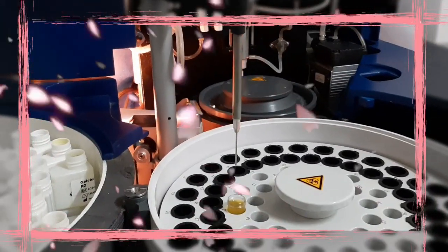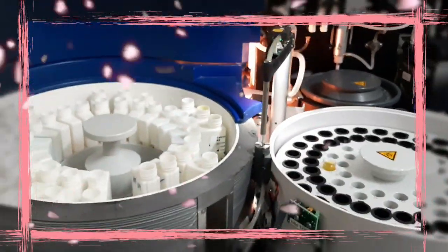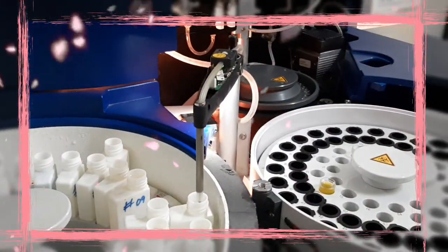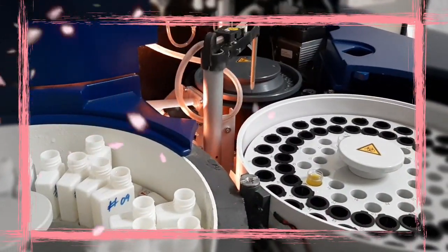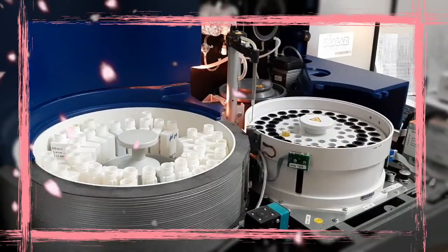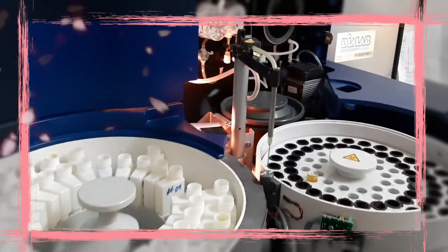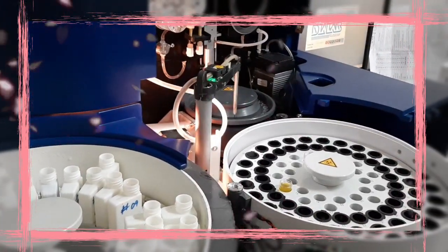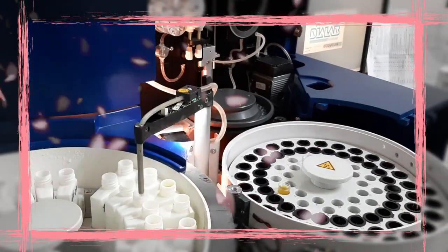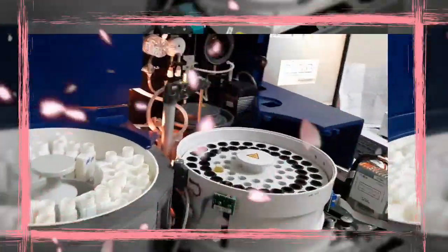I think the 80 microliter bottle is actually for the BT3000 and the 2000. It has a throughput of 250 tests per hour and is very efficient at consuming water. It's not like the other fully automated chemistry analyzers, which waste a lot of the stored water. This one, when you have about 1 liter of water, it can work for almost about an hour without finishing. There's a test directory of up to 500. And an inbuilt QC program with a minimum of 2 levels of control. It's actually 3 levels of control, and it's so wonderful. It has a photometry sensitivity of plus or minus 0.001 absorbance. This is mind-blowing.